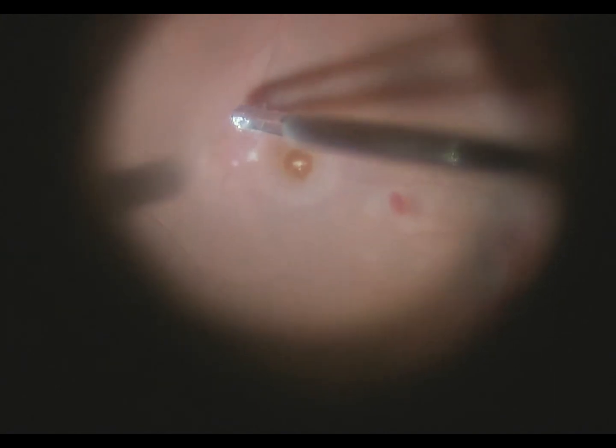Those yellow arrows were pointing to the macular hole, which you can see about in the center of the image. The delicate 23-gauge forcep is almost perfect in proportion to the internal limiting membrane, and allows for it to be removed mostly in a single clean sheet.